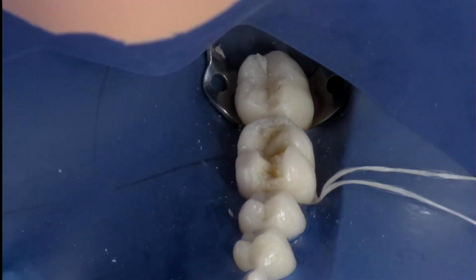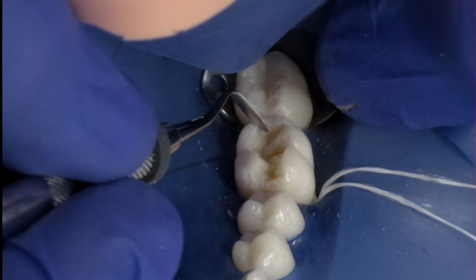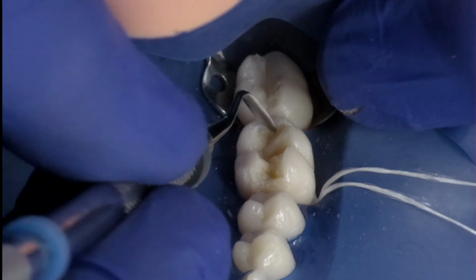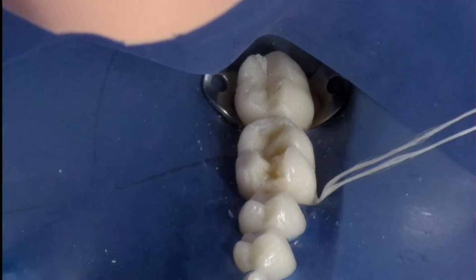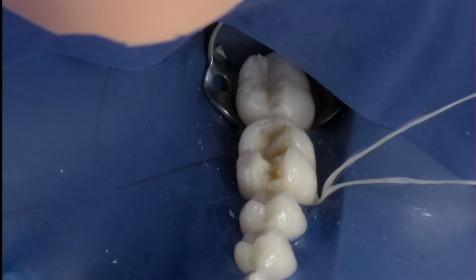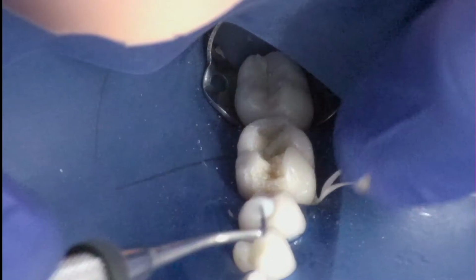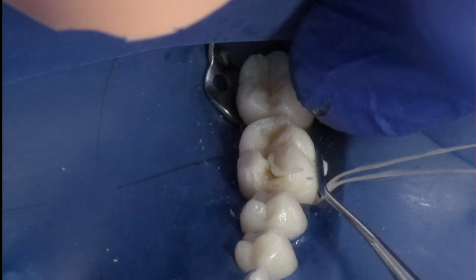Here I'm using that enamel to fill in those fossae. This turned out to be a little more difficult than I expected to get a nice solid fill. I actually found a void after recording, which displeased me a lot. So I ended up having to fill that back in again. So I'll have to be more careful about filling in those fossae with the enamel shade.